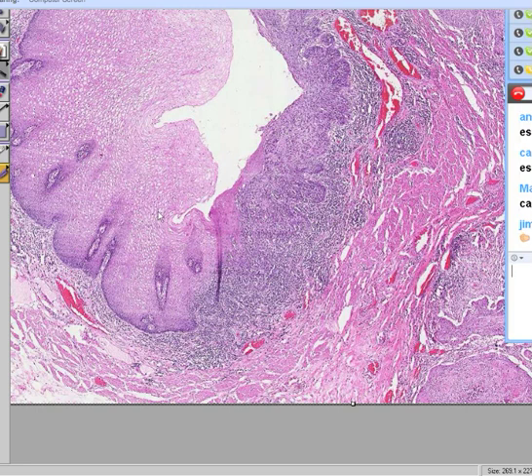But look, there seems to be a relatively abrupt change where you go from the normal maturation pattern from the basal layer to the superficial layer. And now the whole thing just looks darker. And it doesn't look like you're getting that normal maturation pattern. It looks like everything is dark.